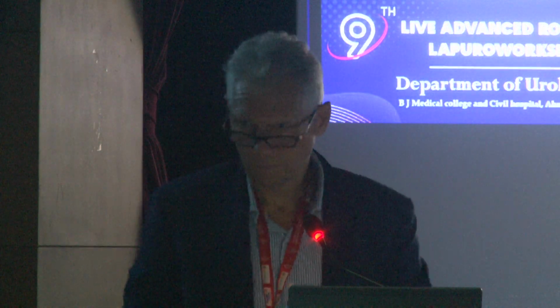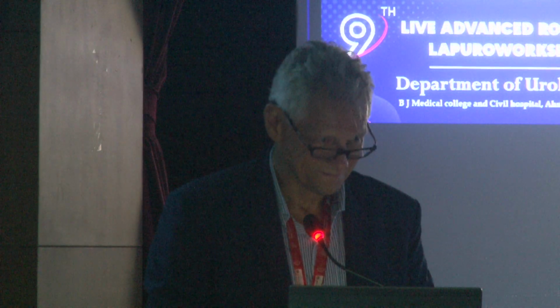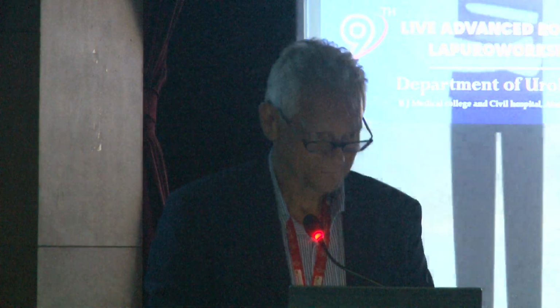Dr. Eric, a fantastic lecture, and I was there in the surgery. Again, another great treat to watch you. What would be the typical learning curve, for the audience, if somebody has to venture into an extraperitoneal radical prostatectomy? And secondly, what are your contraindications, when you would say, no, I will not do an extraperitoneal prostatectomy?